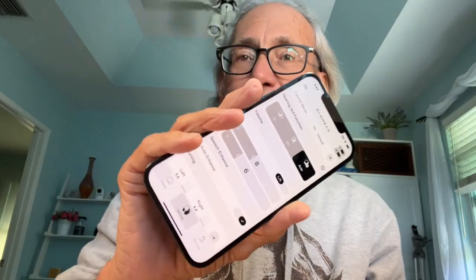All right, it says, congratulations, you're ready to start your hearing aids. I thought we were going to do some kind of test and check them out, but I guess not. Oh yeah, wait a minute. Look, there is some stuff here. All right, so it says, oh, look, I can change the volume here.